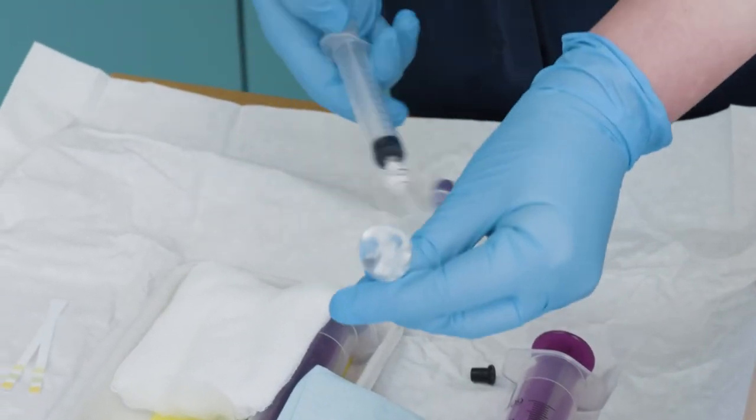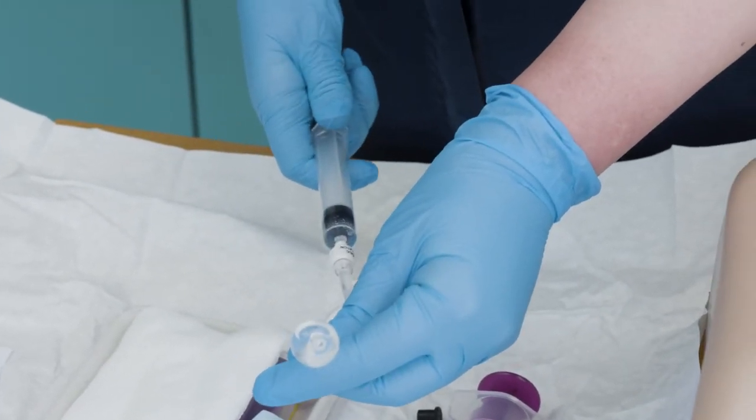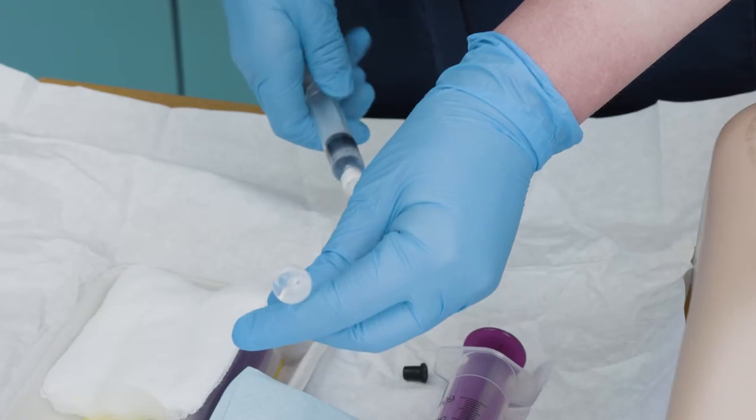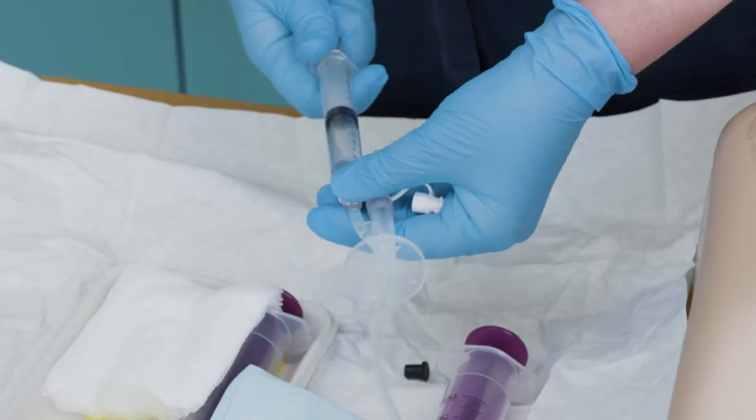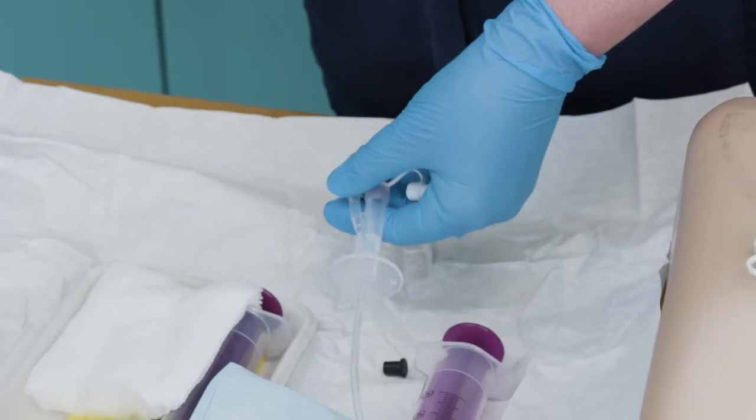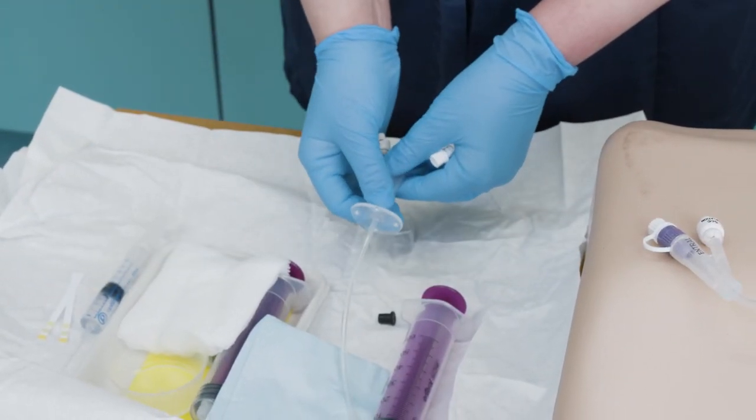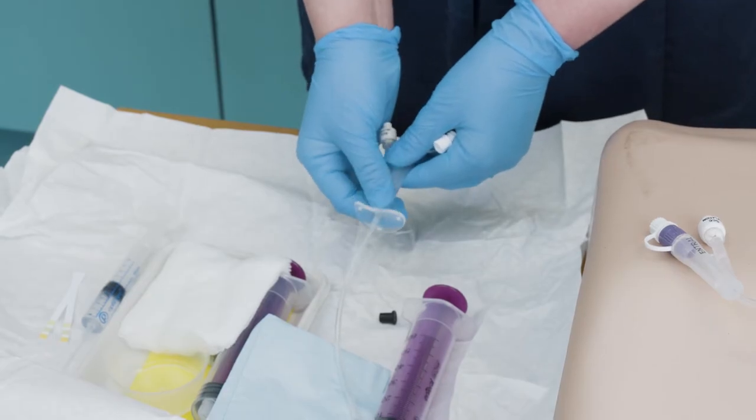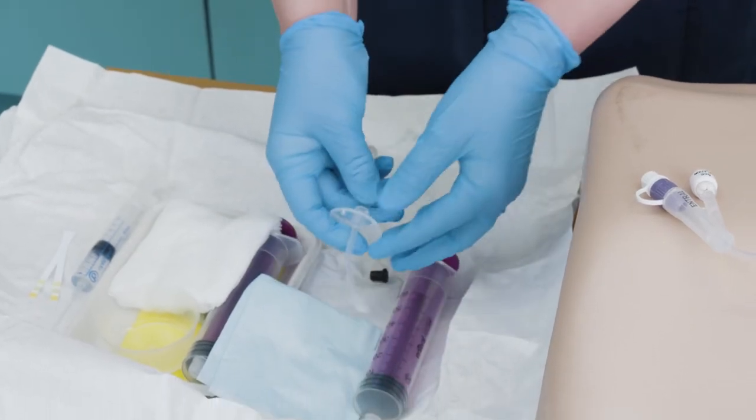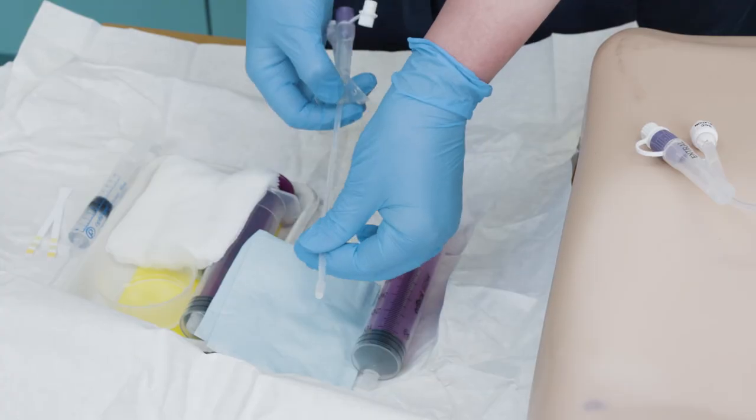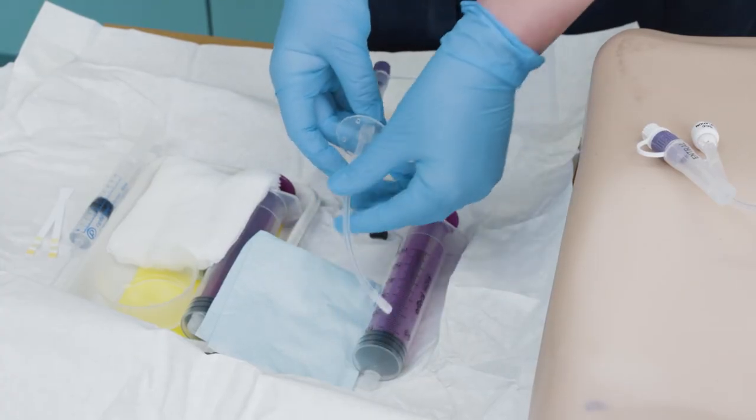Once you are sure that the balloon is working, deflate the balloon. Slide the external retention device of the new balloon gastrostomy tube down the tube and then return it to its original position.